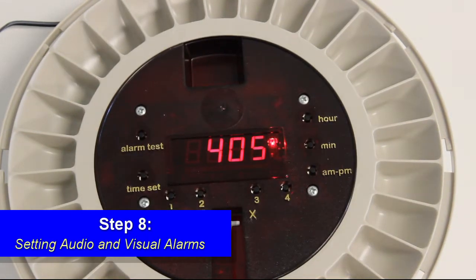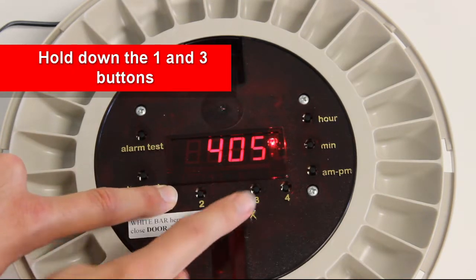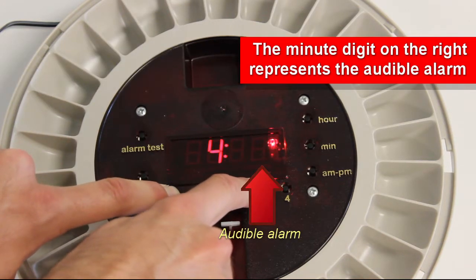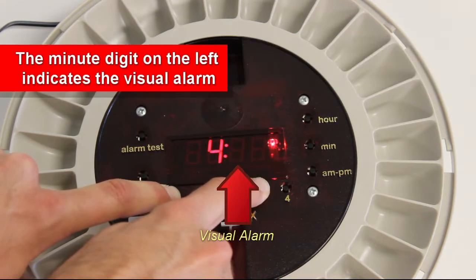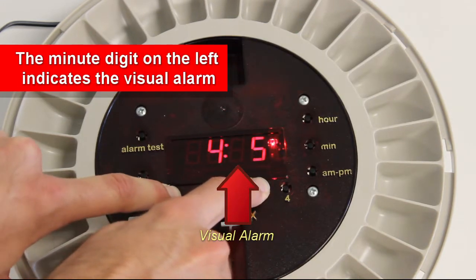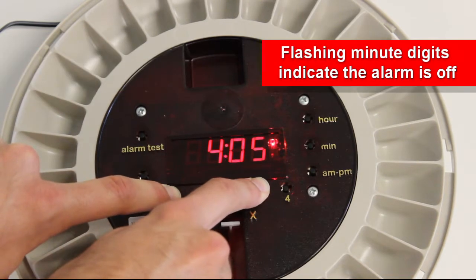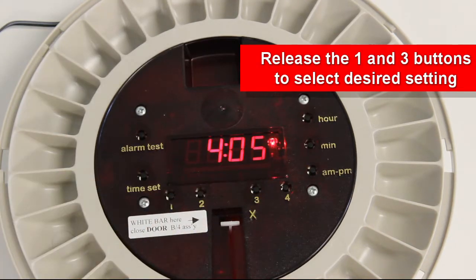Step 8: Setting audio and visual alarms. Hold down the 1 and 3 buttons to rotate through the settings. The minute digit on the right represents the audio alarm. The digit on the left represents the visual alarm. A flashing digit means the alarm is off; a solid digit means the alarm is on. Release the two buttons to select your desired setting.